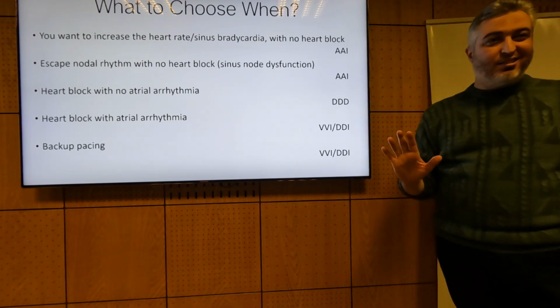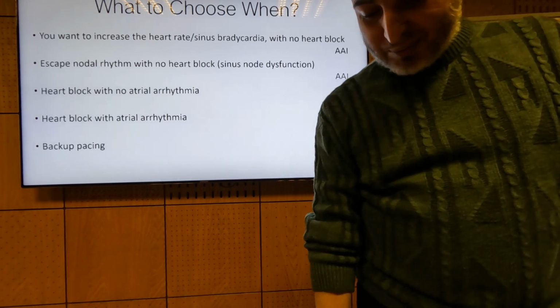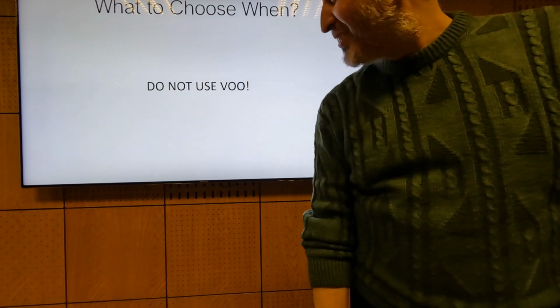Are you still there? Have you got a very broad idea about modes? Okay. Do not use VOO, okay? I cannot stress that more.